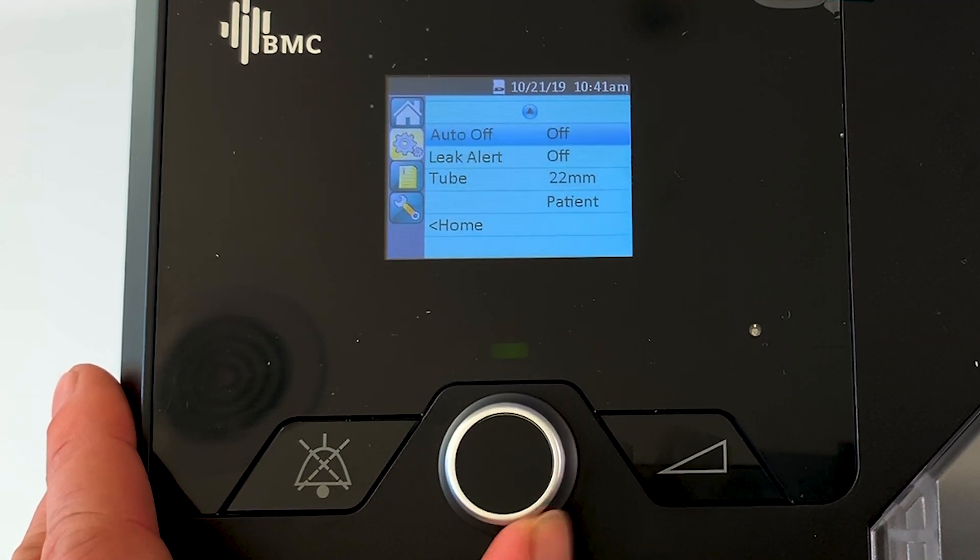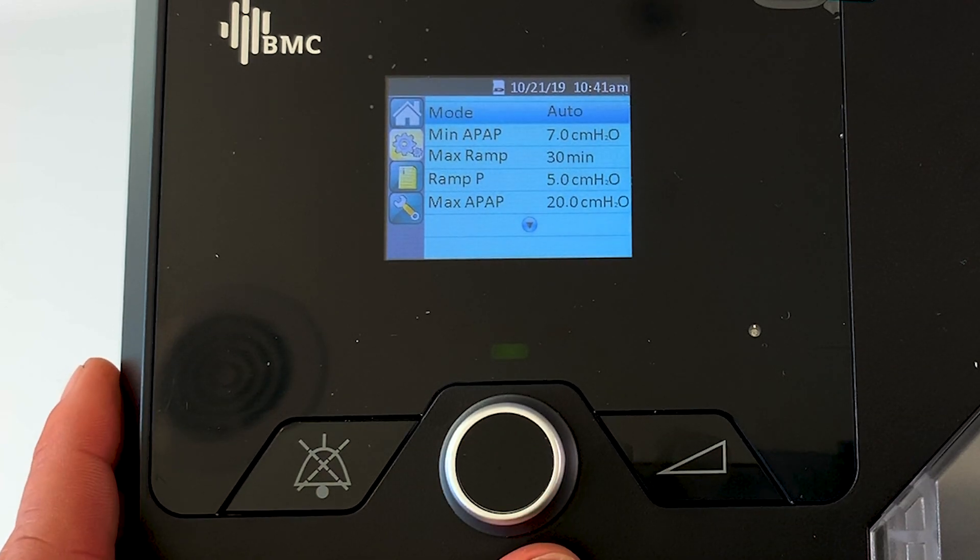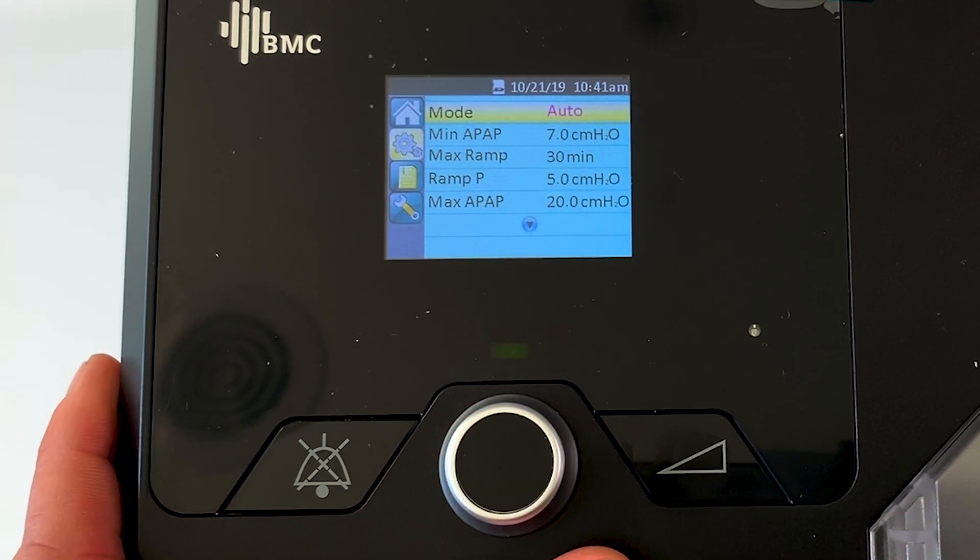Now we can rotate the dial down through the clinical settings and change anything that we require, right down to home when we're finished. Let's go to the top and start from there.